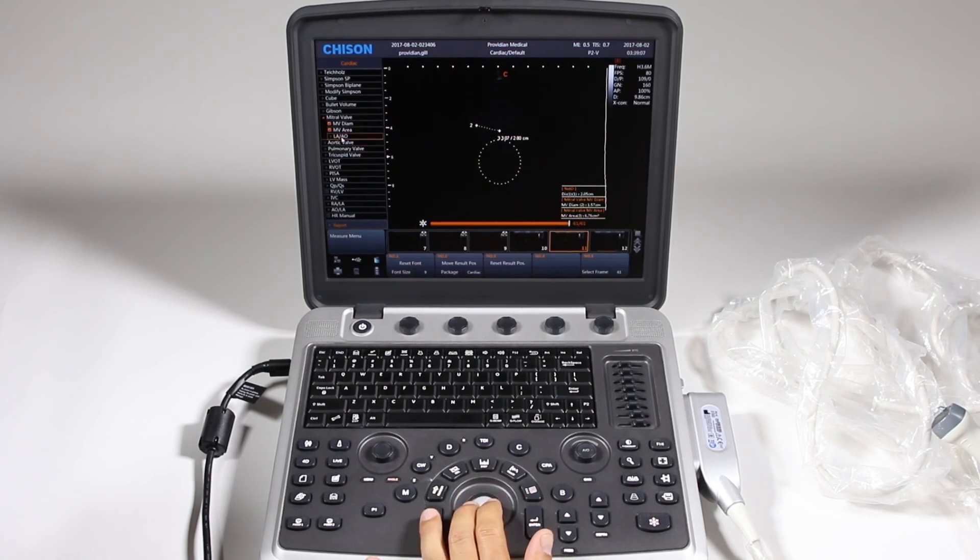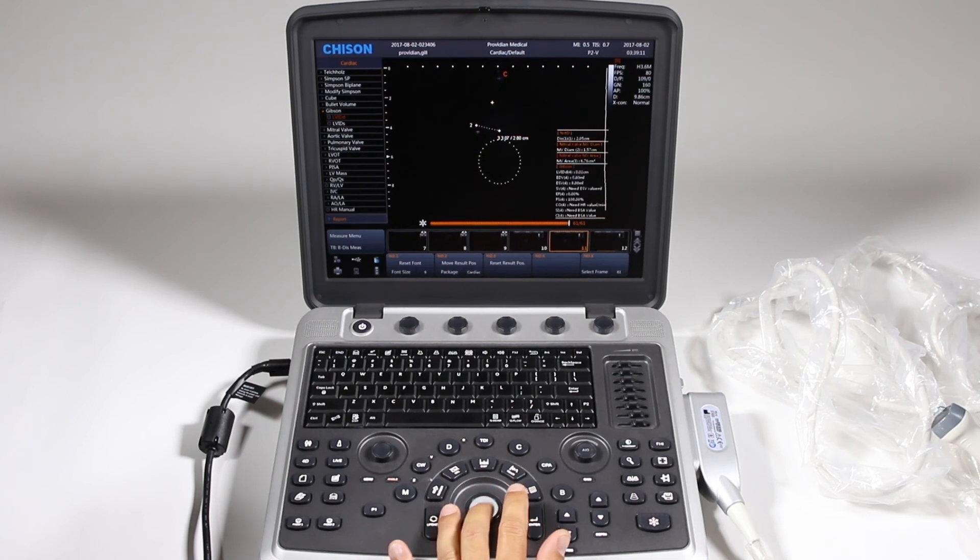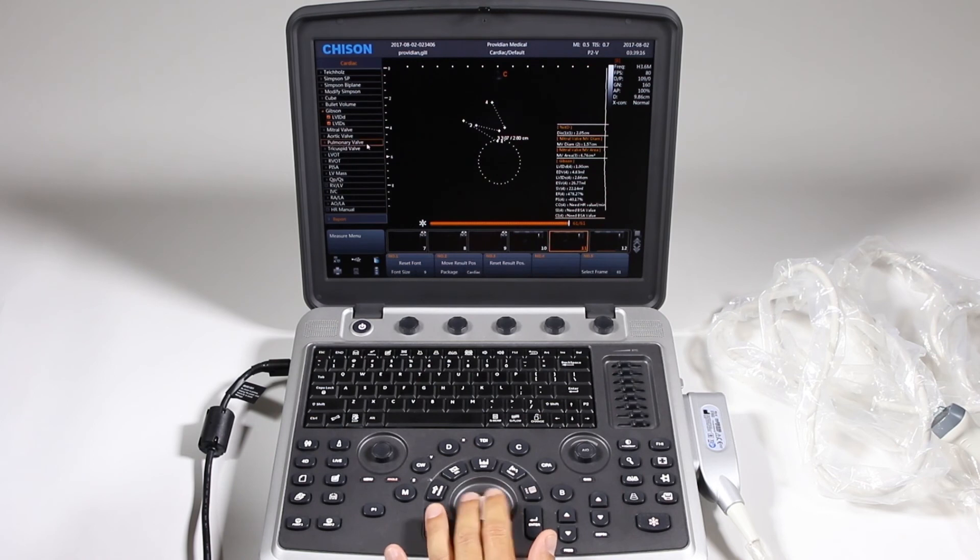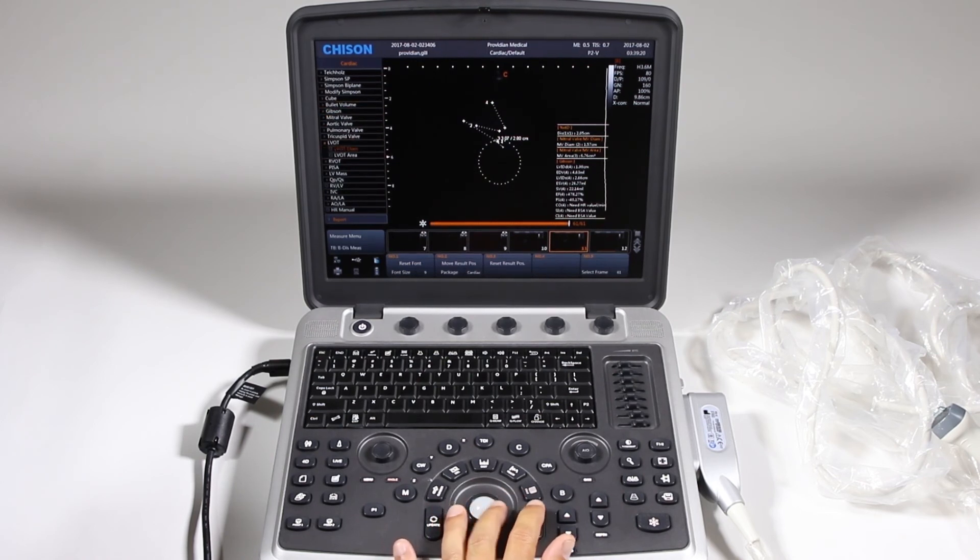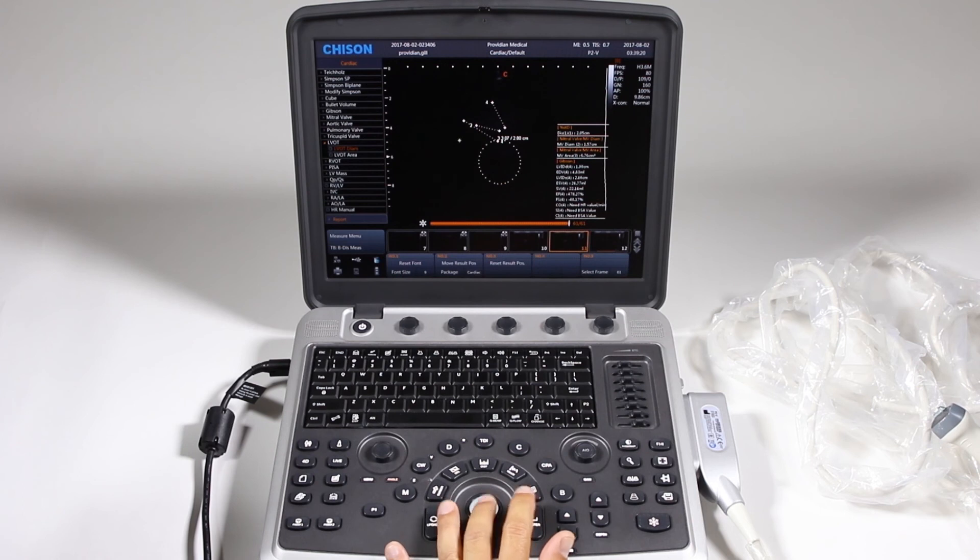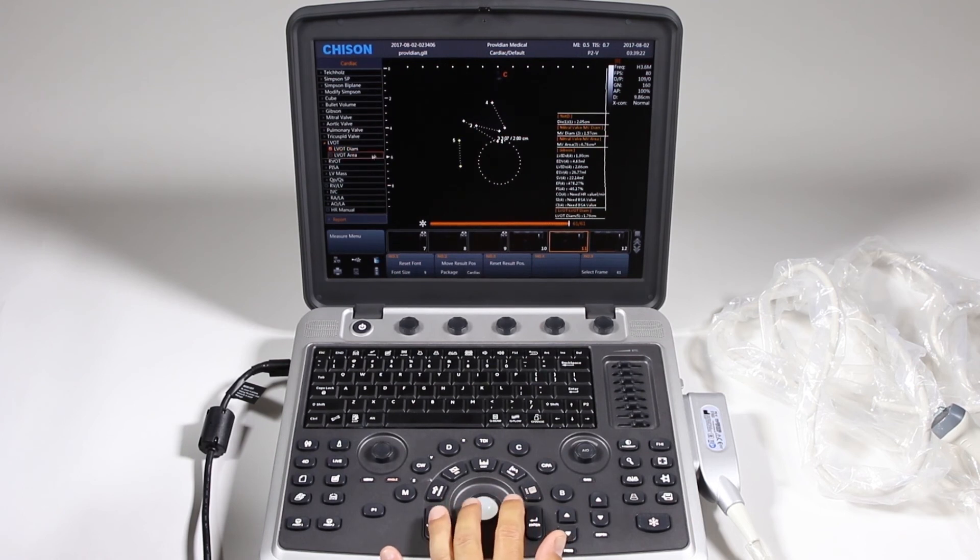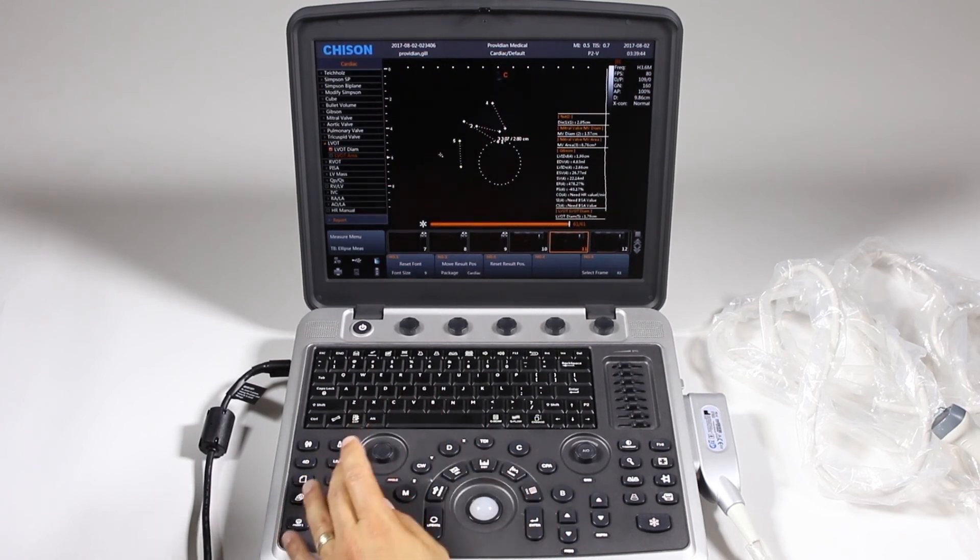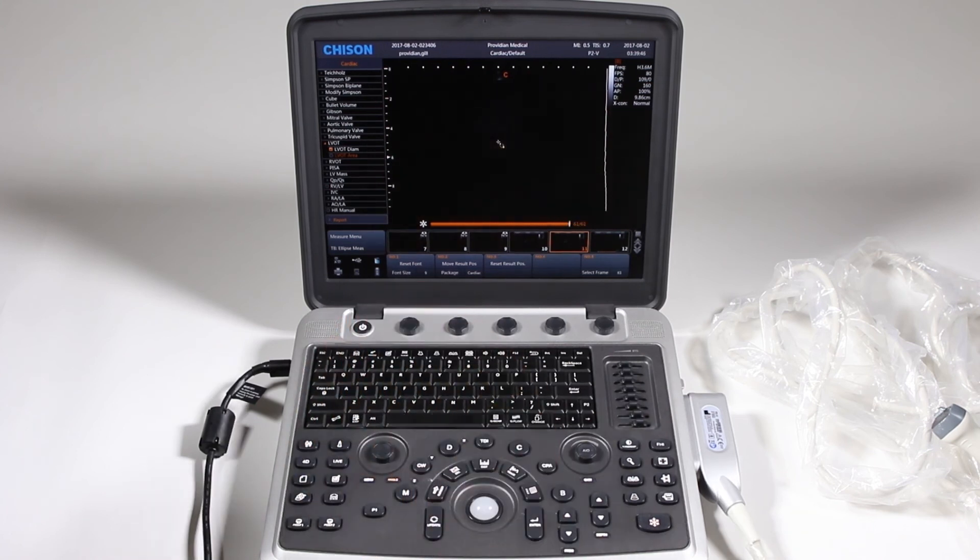So this is how you would go through each measurement and I'm done. See how it selected the next one automatically there? For some of them it will do that. So we'll go ahead and just clear all those measurements.